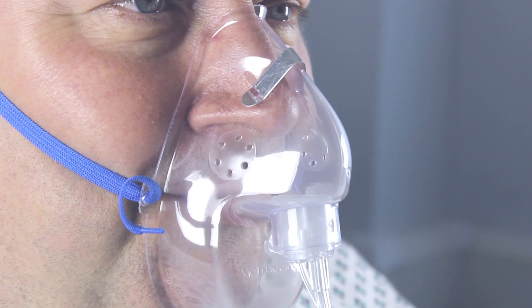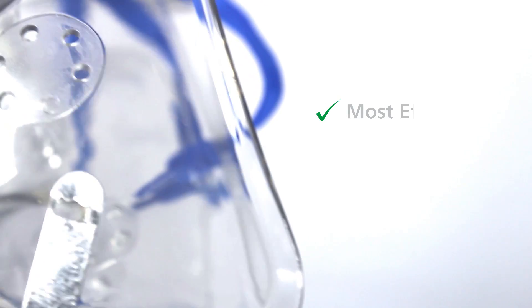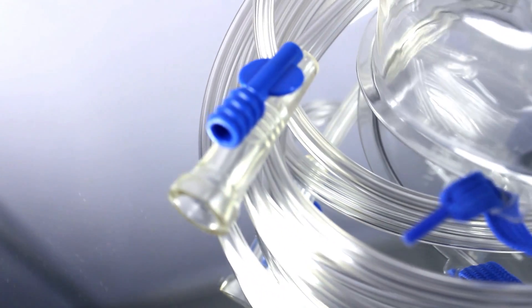The dual oxygen mask provides continual monitoring of carbon dioxide being exhaled from the mouth and nose, whilst administering oxygen to the patient. The integrated oxygen and sampling line provides quick and simple operation. Adult dual masks are also available with a nose clip. The dual mask from Flexi-Care has been proven to be the most efficient in sampling end-tidal CO2. An independent study measured end-tidal CO2 in a simulated patient, with ET CO2 measured at the trachea and by the sampling mask. Star lumen tubing supplied with international standard conforming connectors ensures that the flow of oxygen is maintained.